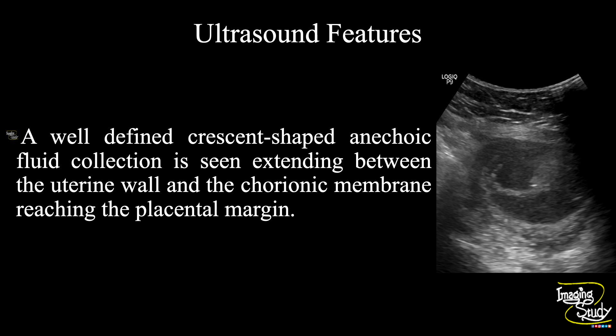So in summary, a well-defined crescent-shaped anechoic fluid collection is seen extending between the uterine wall and the chorionic membrane, reaching the placental margin, indicating this as a case of subchorionic hemorrhage.